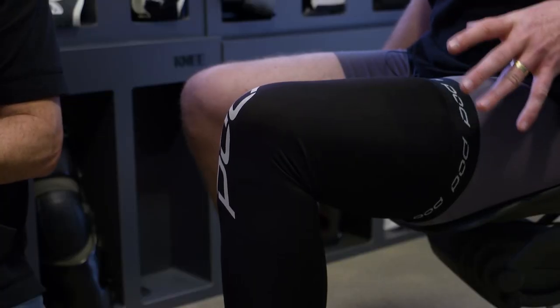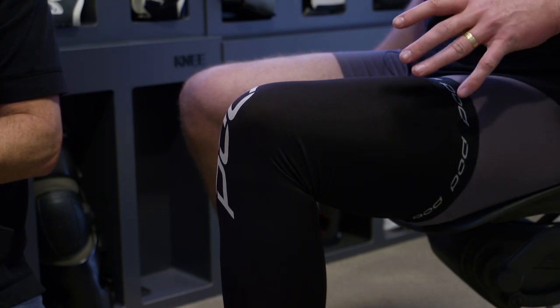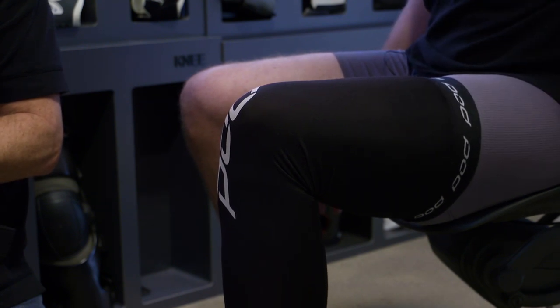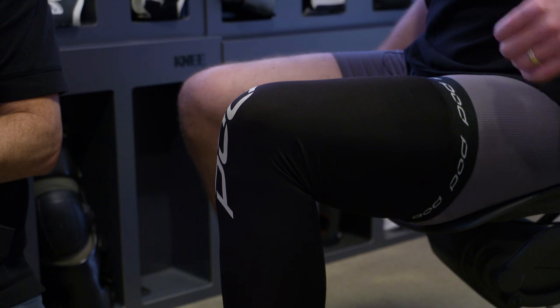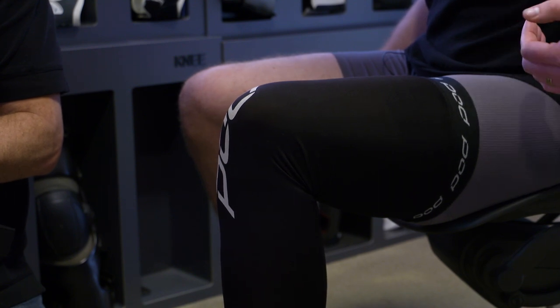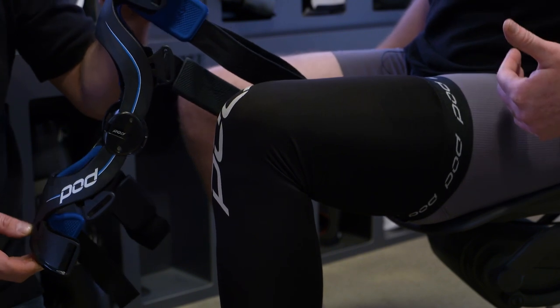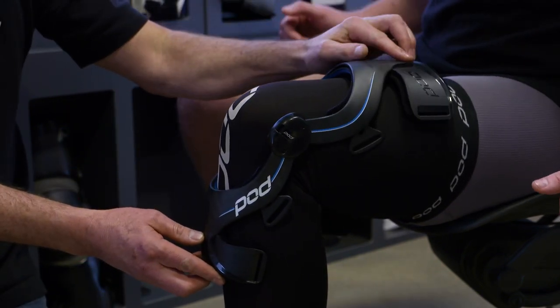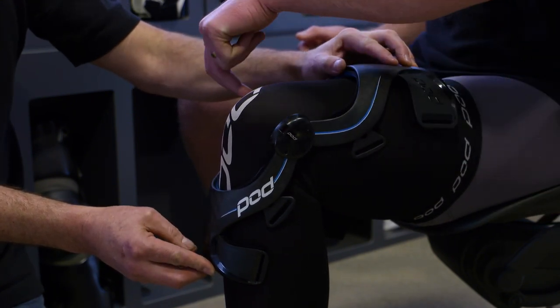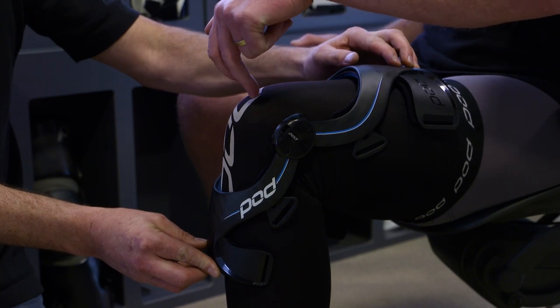We've measured up this leg and in this instance we require an extra large brace. For demonstration purposes, we've taken the impact protection and patella cup off so that we can show you on this K8 premium brace how to correctly align the hinge housing across the top of your kneecap. With the leg in a 90-degree position sitting down, place the brace over the knee and ensure the two Pod logos on each side of the hinge housing cross over right at the top of the kneecap.